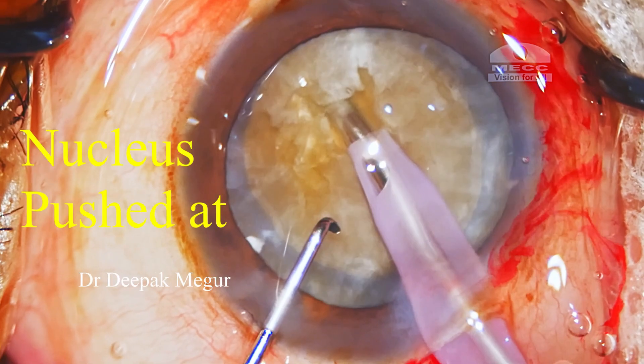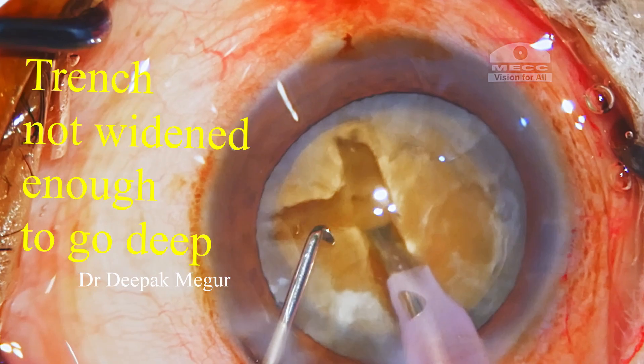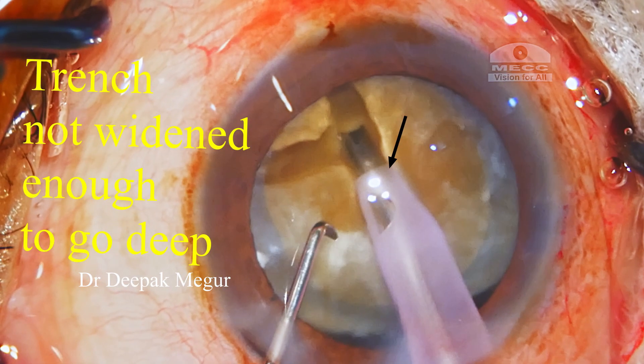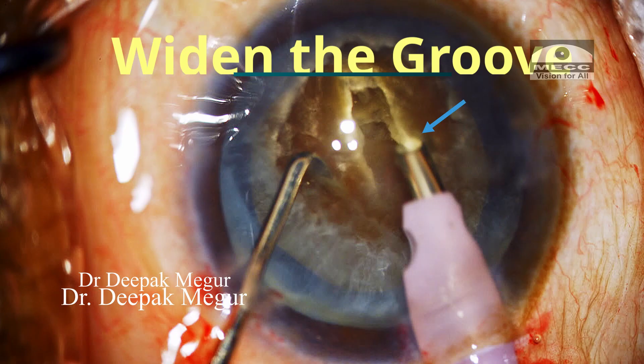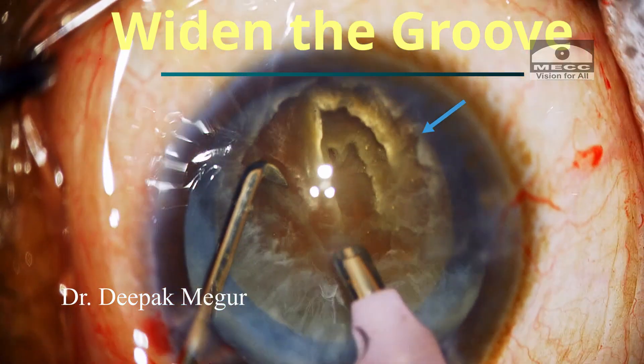To conclude, critically analyzing the not-so-obvious errors is very crucial for us as we proceed in the pursuit of becoming better surgeons. Focusing on these small things is going to help us in a long way. Thank you for your attention and I hope this helps.